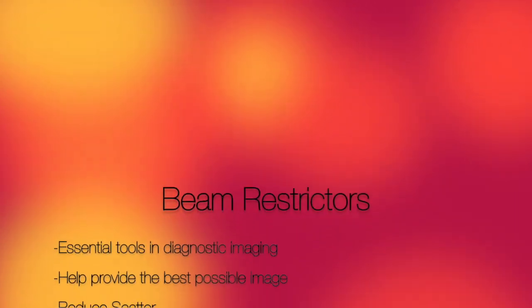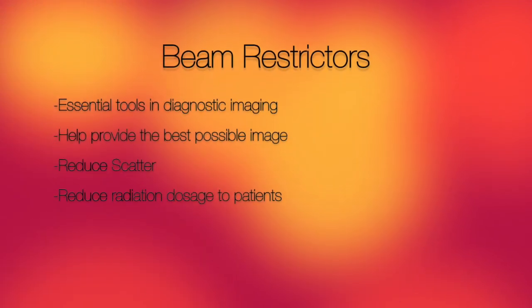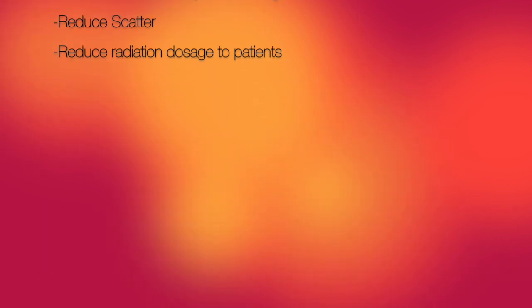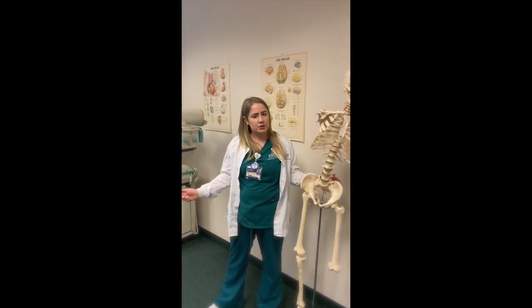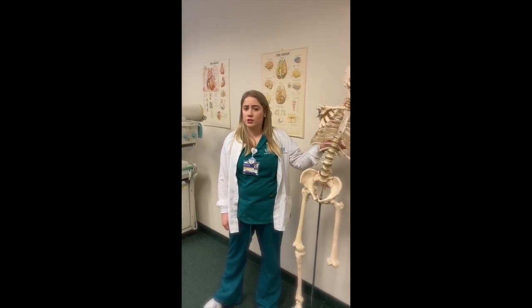So in review, beam restrictors are essential tools in diagnostic imaging. They help provide the best possible image. They reduce scatter and they reduce radiation dosage to patients. In conclusion, beam restrictors are essential tools that are used in diagnostic imaging by technologists all over the world because they help people provide the best possible image and reduce the amount of scatter radiation reaching an image receptor as well as decreasing radiation dosage to a patient.